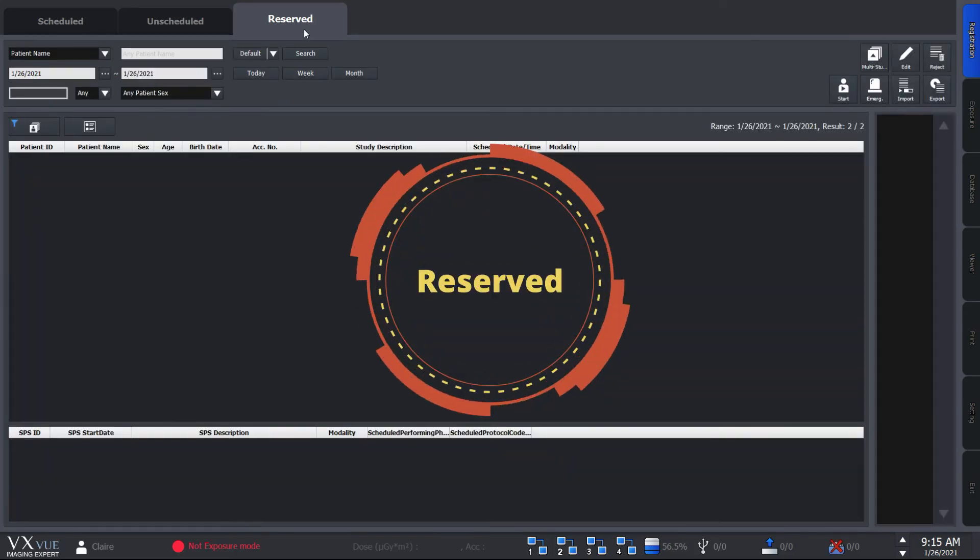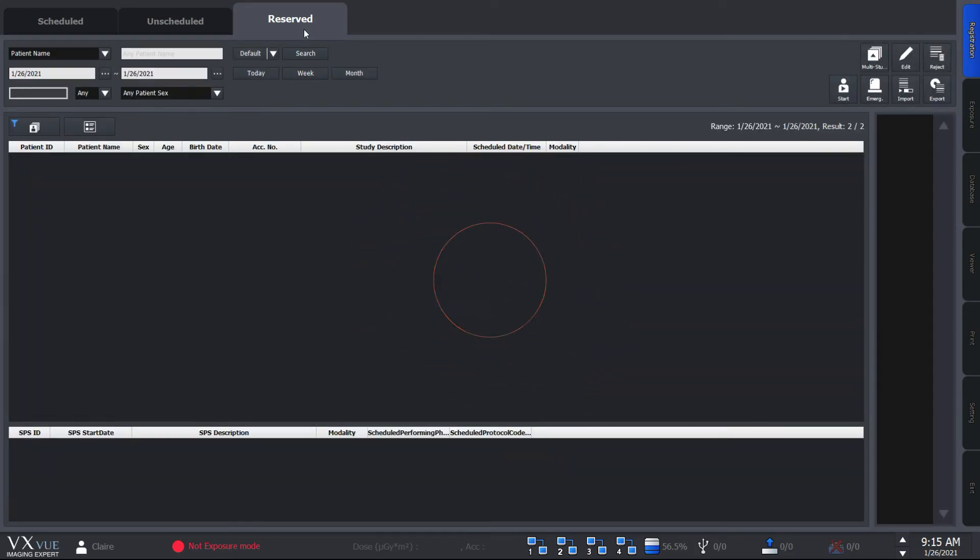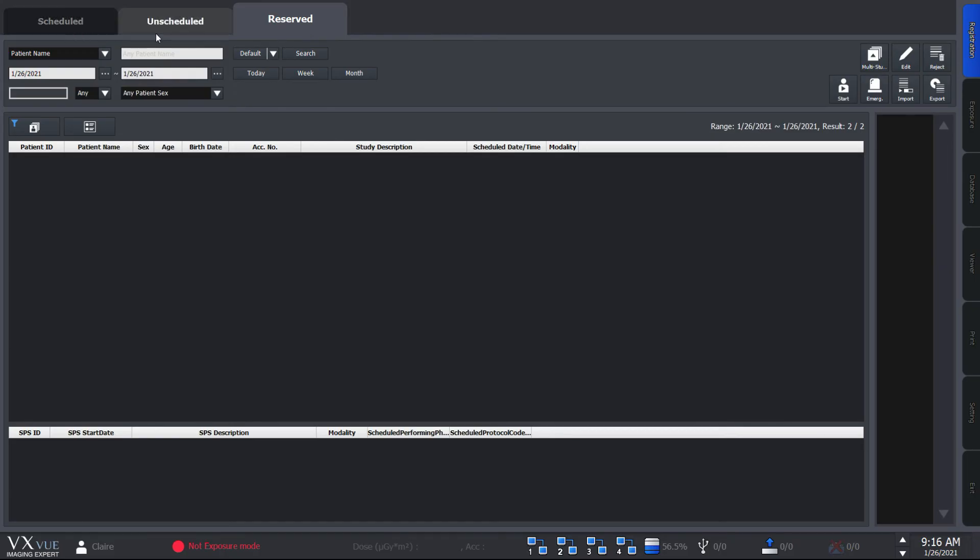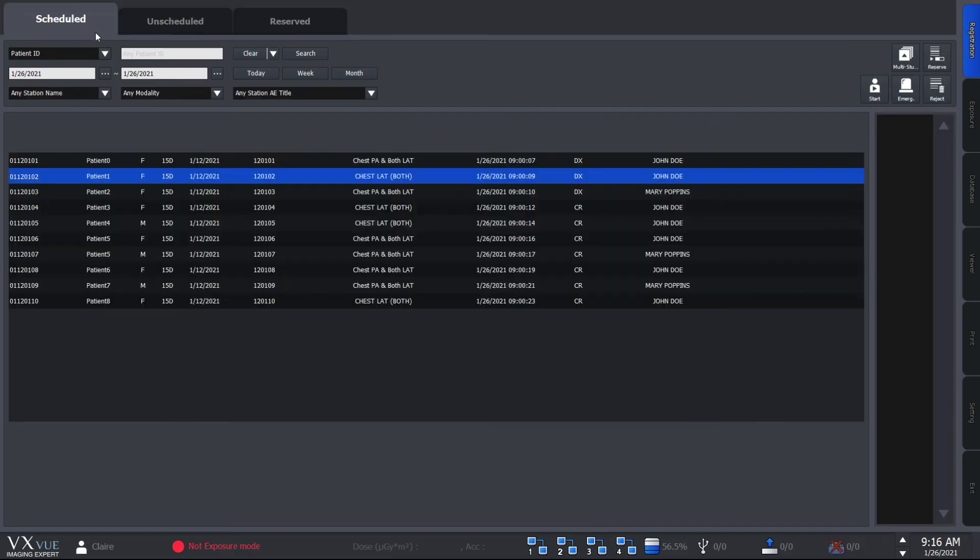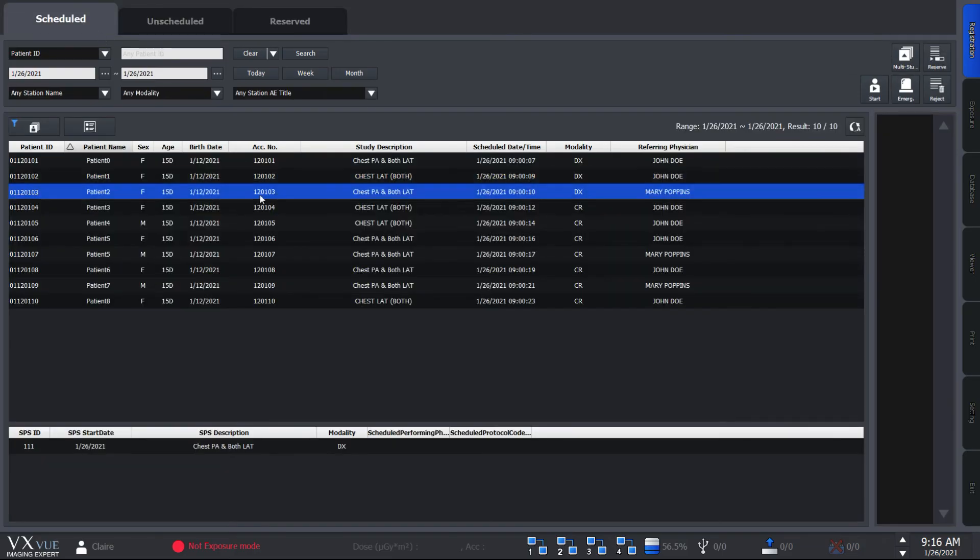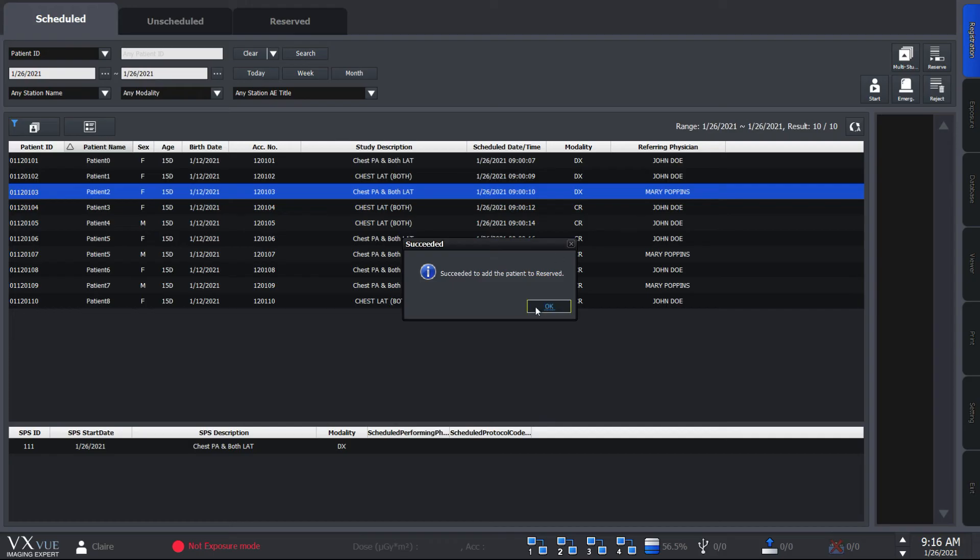Now to the reserve panel. Now reserve panel helps you to manage your reserve patients. You can import patient information to reserve panel from both the scheduled and unscheduled panels. From scheduled, all you need to do is click on the patient you wish to export and hit the reserve button.